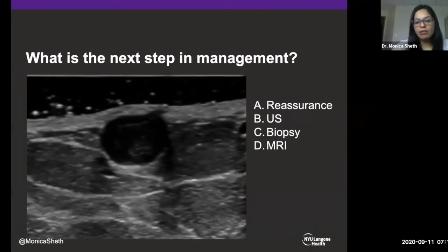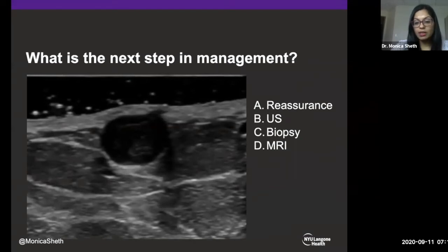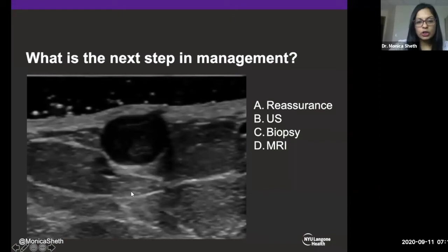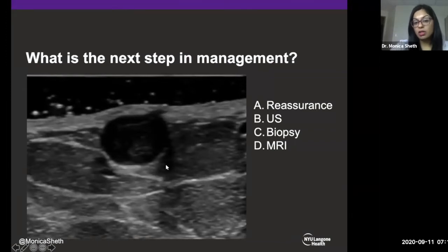Now we have the ultrasound. An image has been taken in the area of palpable concern. On the ultrasound we see a superficial finding — this is the skin. We have a hypoechoic to anechoic mass with increased through transmission and a tiny tail going to the skin. This is a dermal sinus tract, which is pathognomonic for a sebaceous cyst — a benign BI-RADS 2 finding. You are going to offer reassurance to the patient and tell them to follow up clinically.